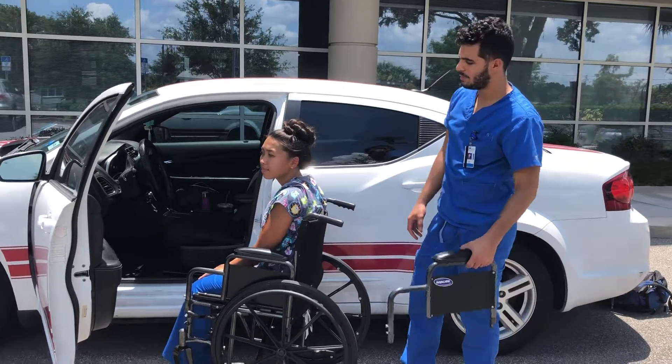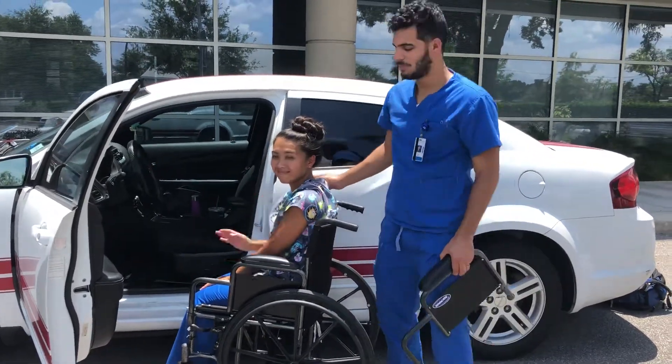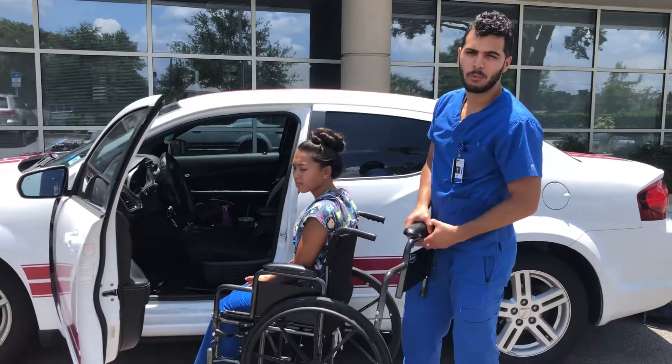Hi, my name is Randy. I'm the student physical therapist. I'm here with Robin, my patient. We're going to perform a wheelchair to car transfer.